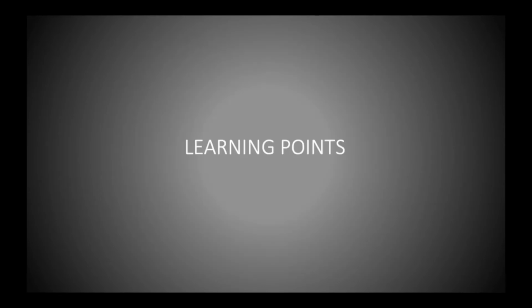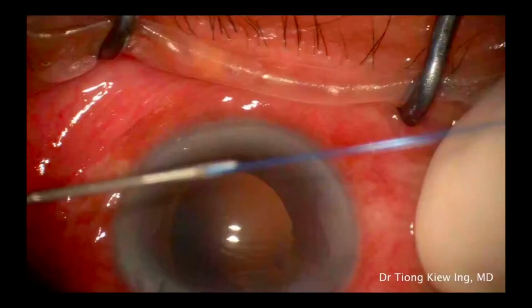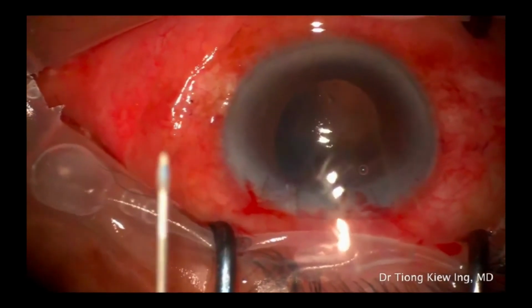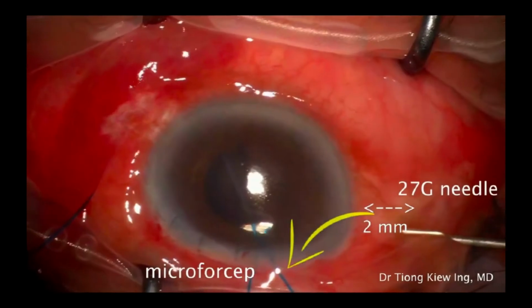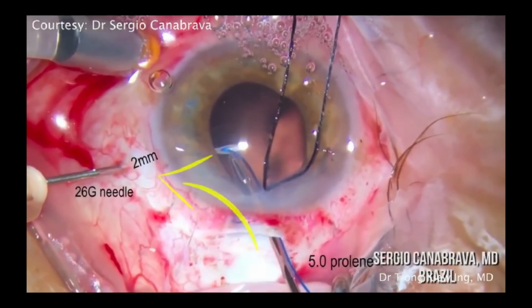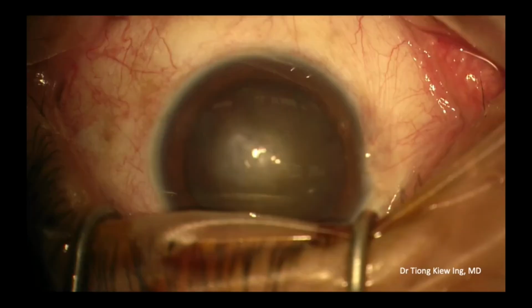What are the learning points from this case? I have found that this technique is easier to master, especially for the young ophthalmologists. With this modification, preloaded suture performed outside the eye can be more convenient and easier for the young ophthalmologist to handle, as the original maneuver is performed inside the eye. This technique is useful, especially in certain cases when the cornea view is poor.